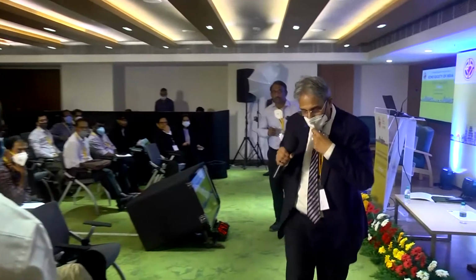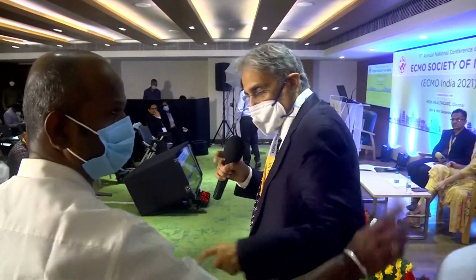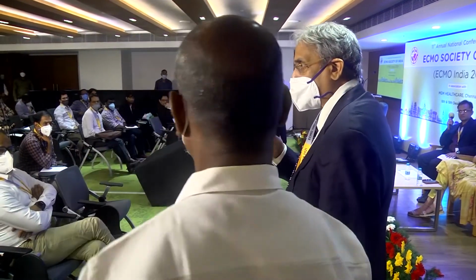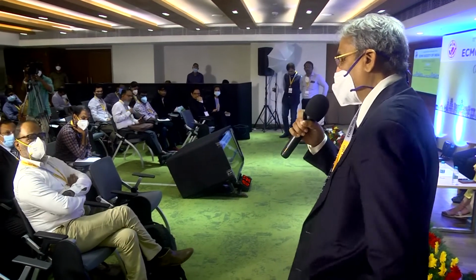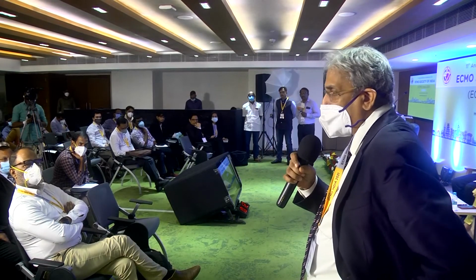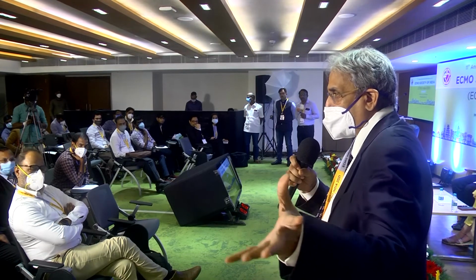I would like to add another important thing. So the question you ask is very important. Cost is a huge millstone around all our necks. So one of the things that we have proposed and done in some instances is that in uncertain situations, like the thing Murali is talking about, these are patients who are waiting for a transplant. So the economics are sorted out. The very fact that they're listed for a transplant means the money is less of an issue than in, say, cath lab or emergency. You could use a regular heart-lung oxygenator.